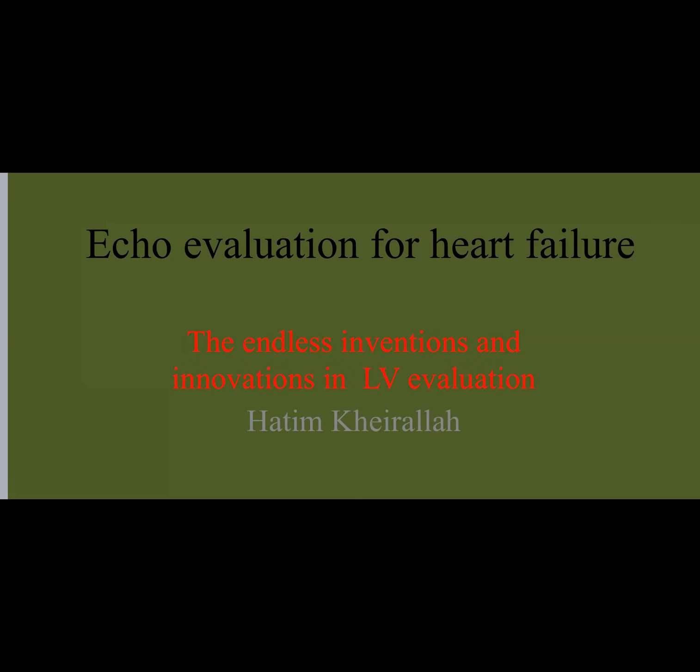Okay, because this part of echo is a so dynamic target. The way we are evaluating things will always be changeable. No imaging technology will remain the same for any measurement, because the more technology improves, the more it will incorporate better ways of evaluation.